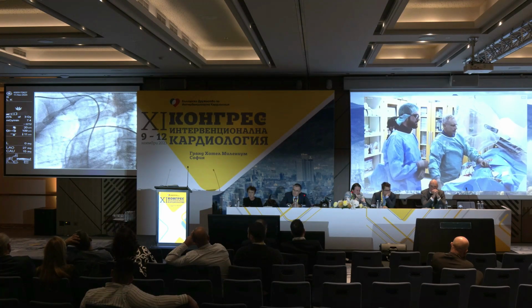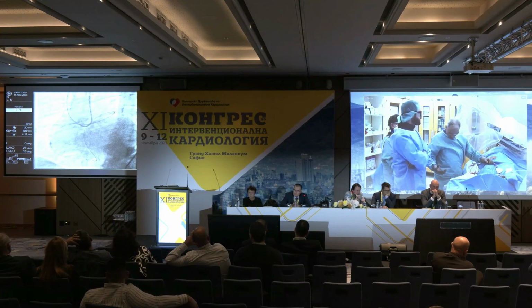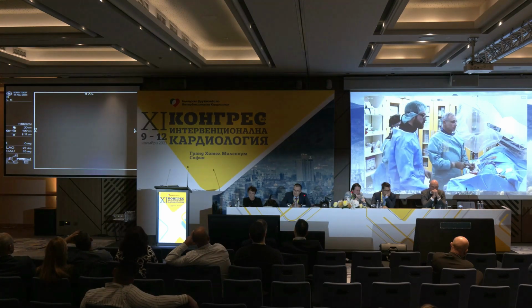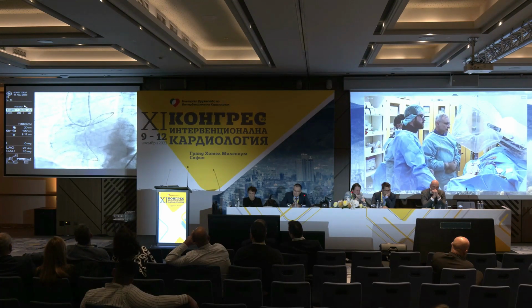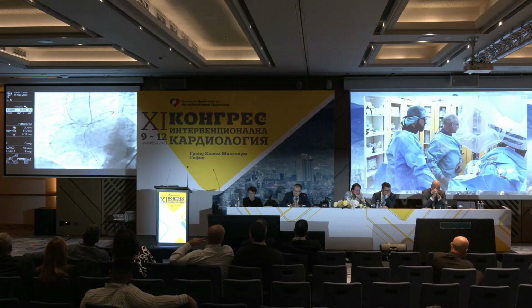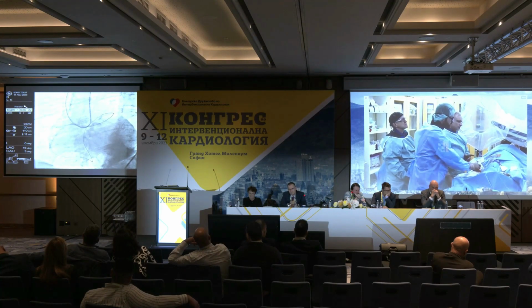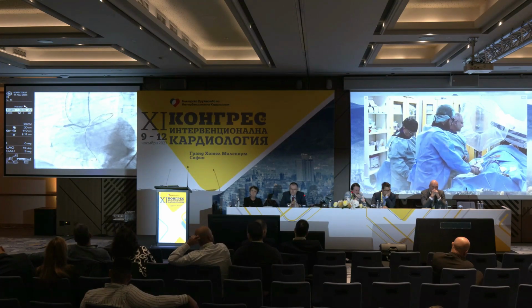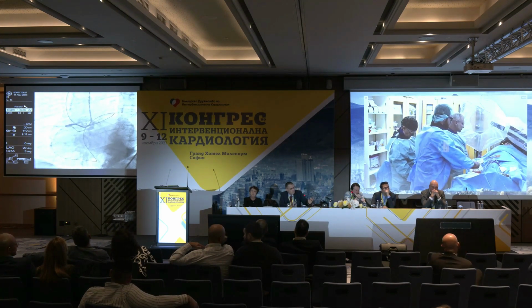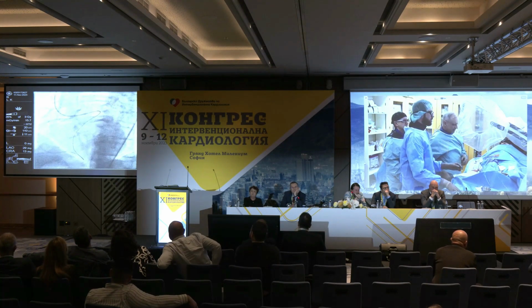But I needed length. So essentially now, if I may say what is going on, I have the feeling, I hope that the wire is not subintimal. In a way, it looks like okay. Because the vessel is big, we have the microcatheter where it has to be. Let's go into different directions, because there is always a possibility, a small possibility, that we are subintimal and we're entering the aorta outside the true ostium. That possibility always exists. But I think we are not.